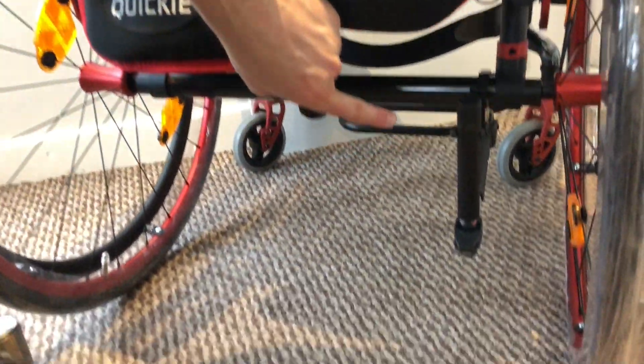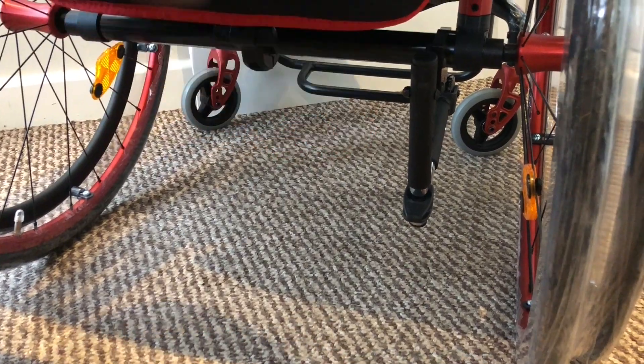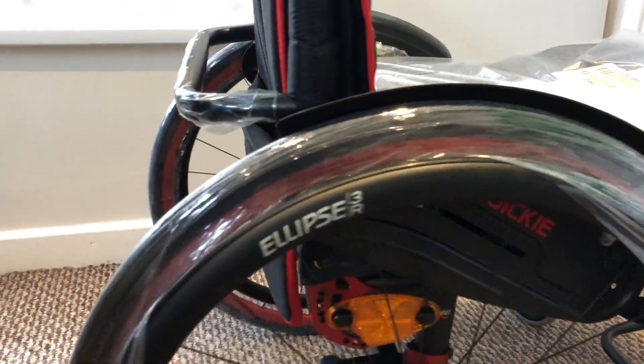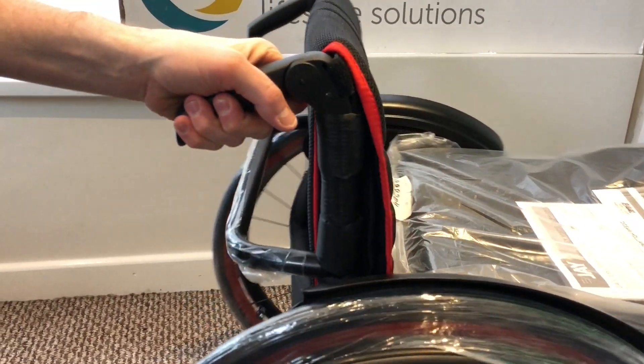The customer's also gone, as you can see on the bottom, for an anti-tip swing away to the right, so it swings in to the right. And the other option they've gone with is some push handles.